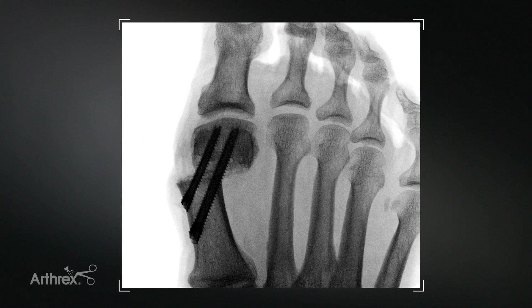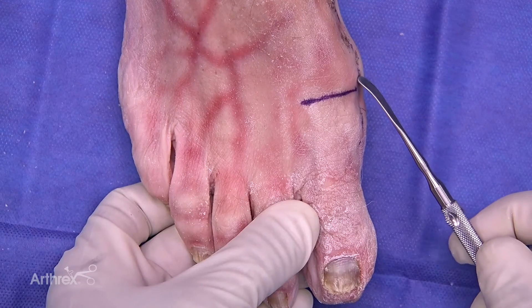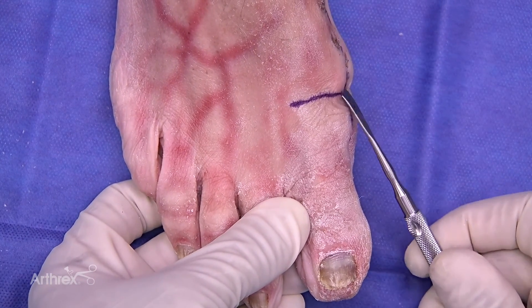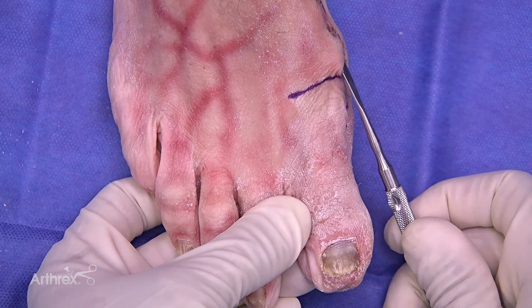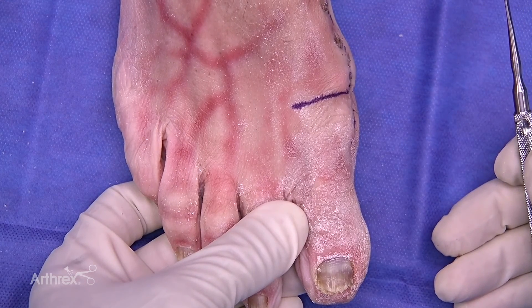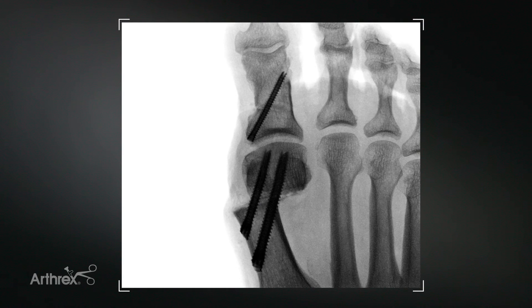At this stage, we have achieved our objective, which was to translate and rotate. On x-ray, you can see there is a bony ledge. I typically try to palpate for it — I will do some small periosteal elevation over the bump and decompress it with either a burr or a small rongeur. We recommend to complete the procedure to do an adjunctive Akin osteotomy. Not only does it provide a better clinical appearance, it realigns the extensor and flexor apparatus. At this stage, you can see our hallux valgus correction has been achieved.